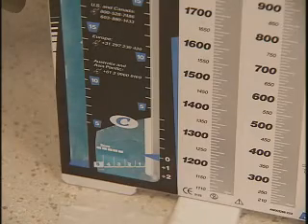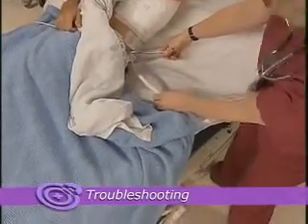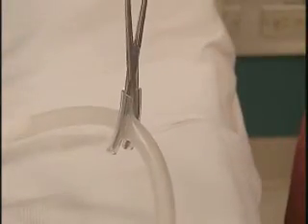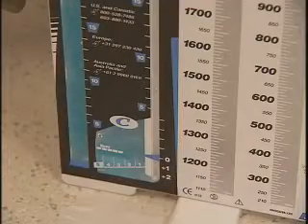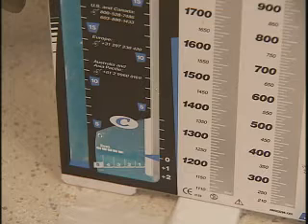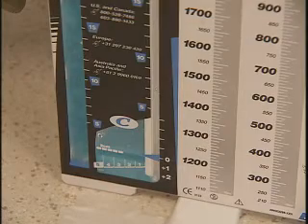pleural space. To locate an air leak, place a padded clamp on the tubing closest to the insertion site. To avoid raising the pressure in the pleural space, don't clamp the tubing for more than 10 seconds at a time. With the clamp in place, check the water seal chamber for continued bubbling. If the bubbling stops when the clamp is placed near the chest wall, suspect an air leak in the pleural space or the lung.